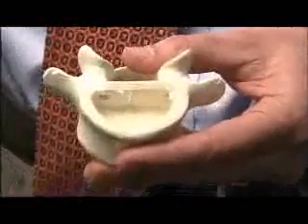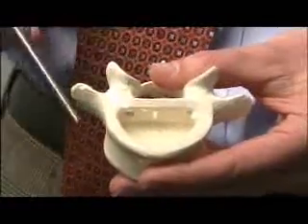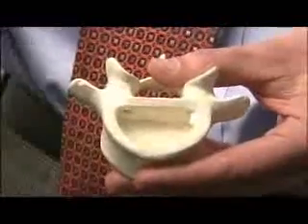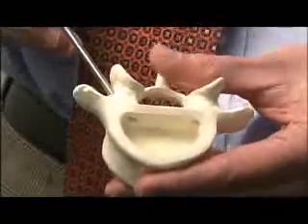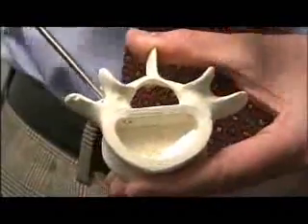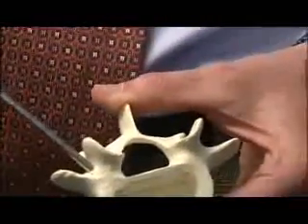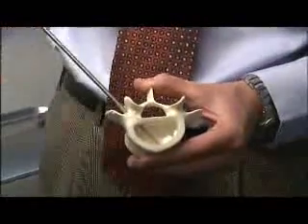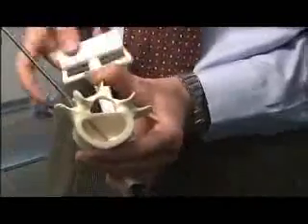Here is a model that shows the actual procedure that we perform in the operating room. If this is a vertebral body that has had its superior end plate, or the superior aspect of the bone, removed, we actually will place a needle into the bone on either side under radiographs in the operating room. And through that cannula, we will place an inflatable bone tamp, which is essentially a balloon that goes down through this cannula into the vertebral body. And then that balloon is inflated with a solution that we can visualize under X-ray.